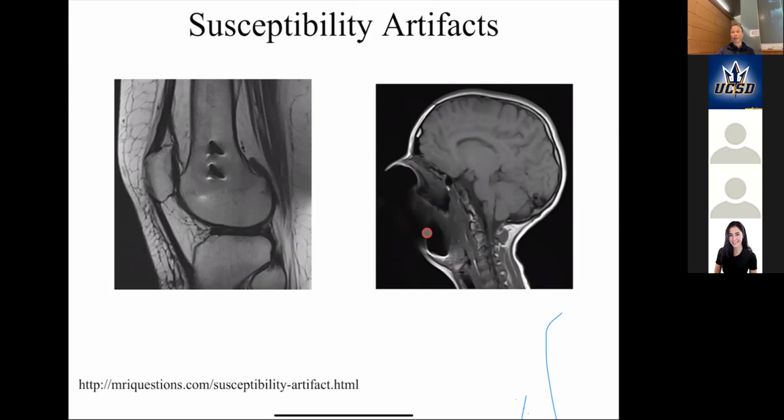That's going to perturb the magnetic field and cause a lot of dephasing and make it disappear. Now, if you're not imaging the mouth, maybe you can still get away with it because you notice that this part is okay. But in some cases, especially if you're trying to do very sensitive measurements, it may not be okay, because if they're moving slightly, that can change how that magnetic field interacts with even farther regions. In fact, even when you breathe, the fact that your lung changes volume changes the magnetic field around it, and that can affect the signal all over.